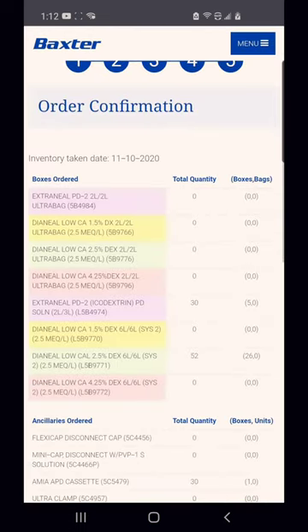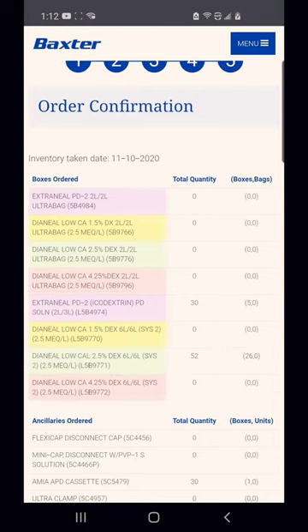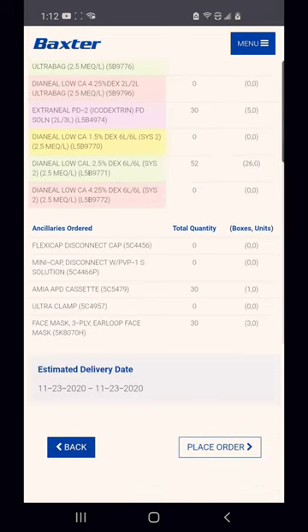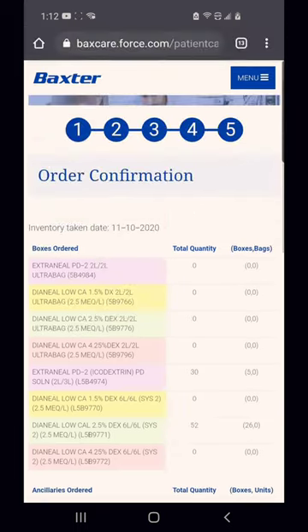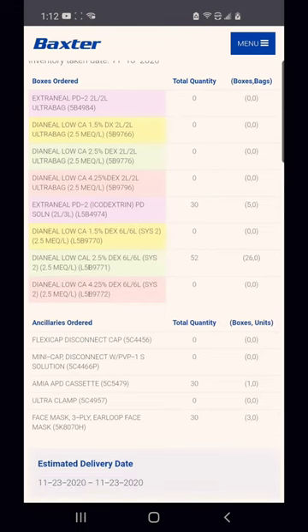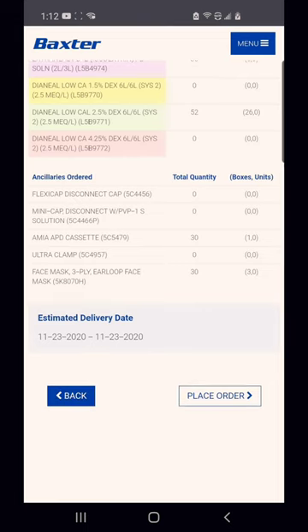And then it just shows you everything you're ordering. So it shows the purple bags and the green bags and how many boxes I'm going to be getting and the total quantity. And if I scroll down, it shows everything else I got, the PD cassettes and the face mask. So this is just a summary, so it's good to look at it just to make sure that you didn't miss anything. And then it tells you the estimated delivery date. It's going to be on the 23rd.